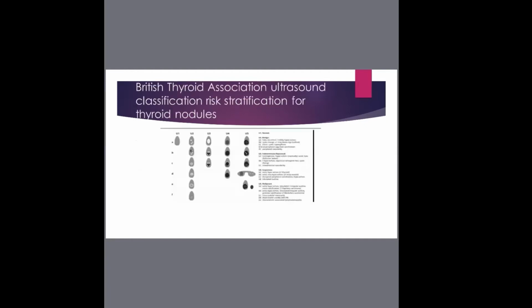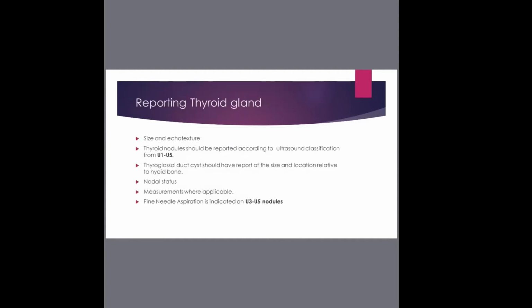Now, the size and echo texture. By the size, I'm not saying you should put the size and say 3 centimeters by this, that. You can do it, but I don't think it's going to add anything to the management of the patient. If it's enlarged, it's enlarged. If it's not enlarged, it's not enlarged.